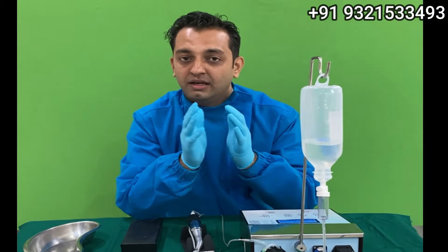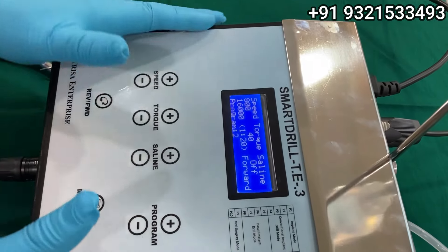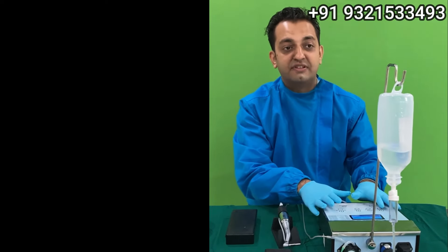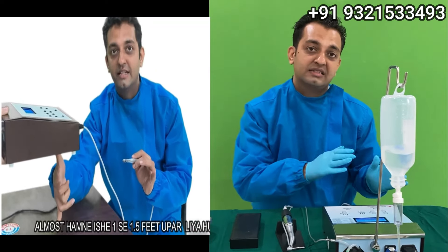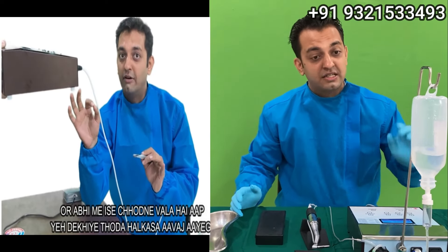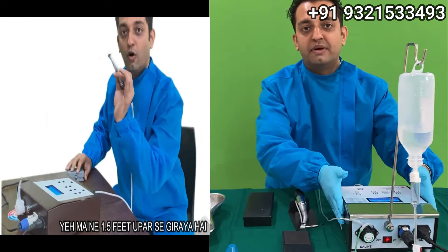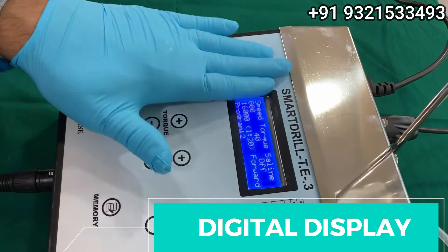Let me show you this machine very closely. As you can see, it is made of a rough steel body. The advantage is that if there is any physical damage by mistake, nothing happens to the machine. High-end machines with fiber bodies can sustain minor damage costing you 40–50 thousand rupees. I have made a separate video where I dropped the machine from two feet height — it's a rough and tough machine.